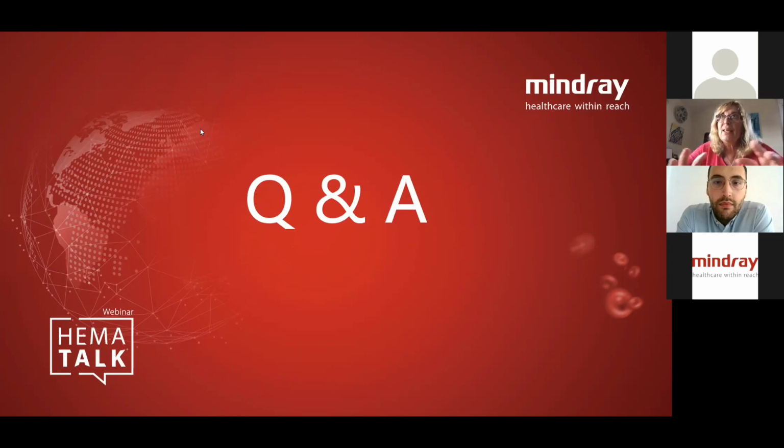On the screen, if you have only 3, 4, but they are together, it's easier, I think, for the morphologists to recognize this. These are some of the advantages, summarizing. I think the efficiency of the hematology lab will be better using these digital morphology analyzers.